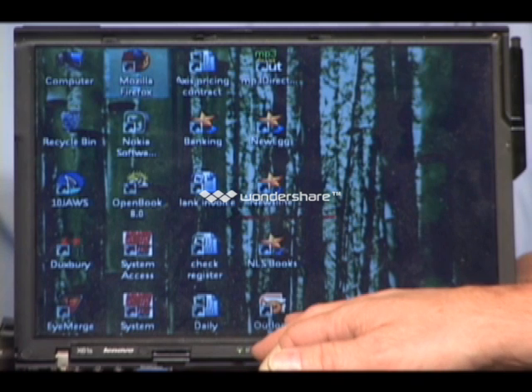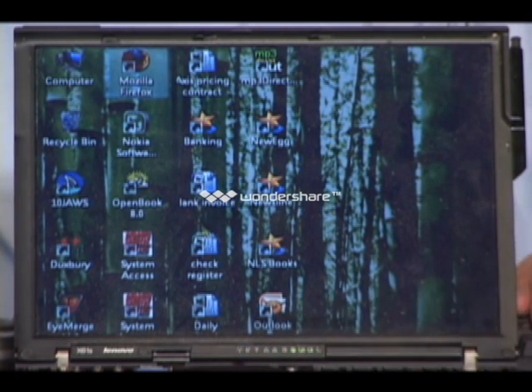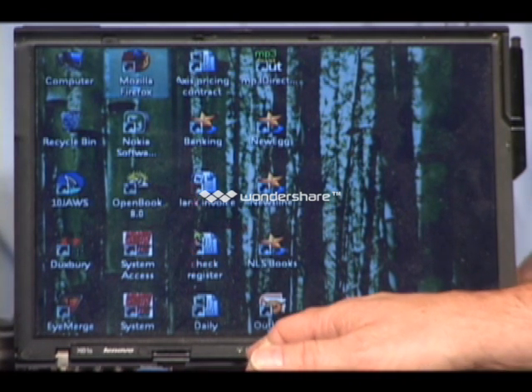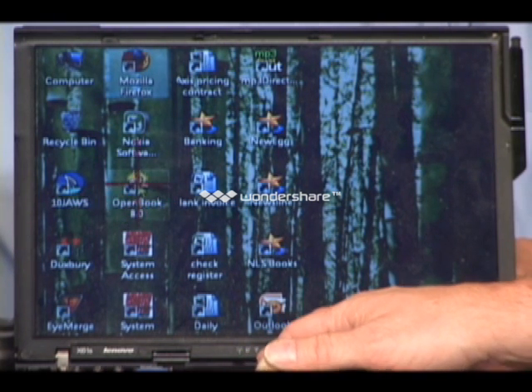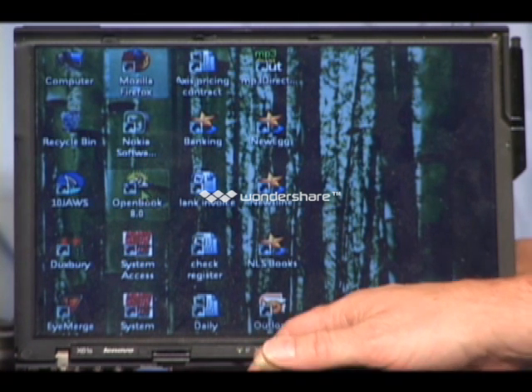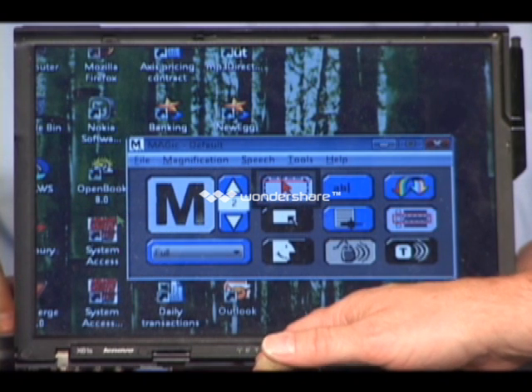Okay, I'll have Vanna do this for me because it helps to do this. There are settings here. As you move this mouse around, right now it is set to do this. You can set it for other ways. Magic is putting an X where the mouse is so you can see it. My wife has low vision, and she says to me, where did my mouse go? And so sometimes, I'm going to go back over here and change that.